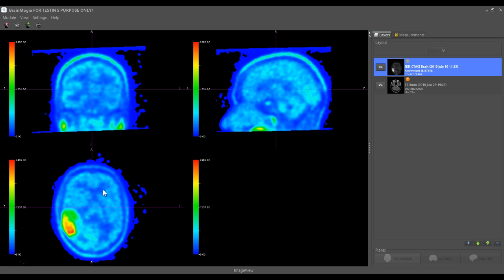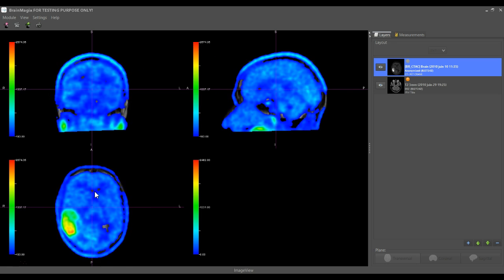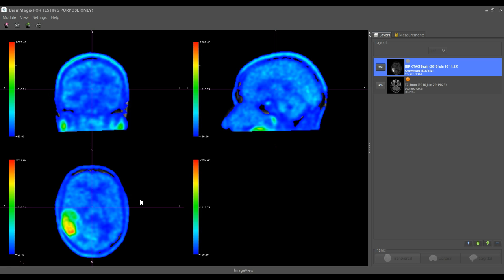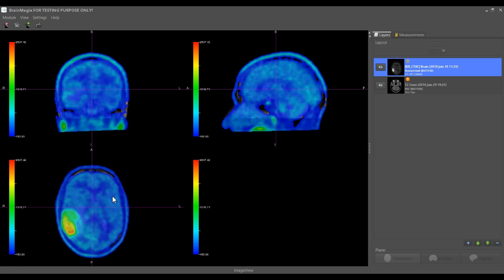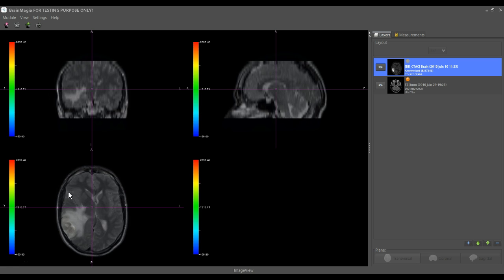We can change the brightness and contrast like this, and we see a zone which is really enhancing. It's not an FDG PET scan — it's a methionine PET scan. Methionine is a specific tracer which binds to brain tumors. We can now fuse it transparently by moving the mouse with a left click, making it possible to really correlate the information in the PET scan with the one in the MRI.